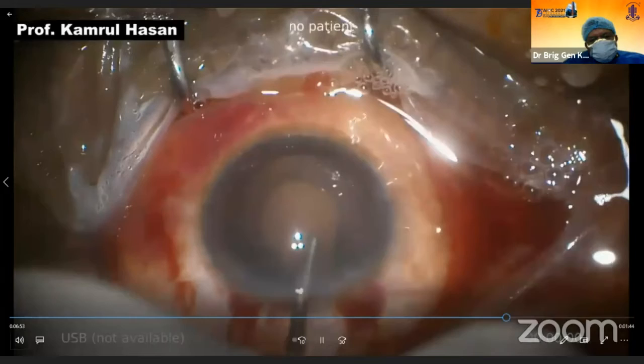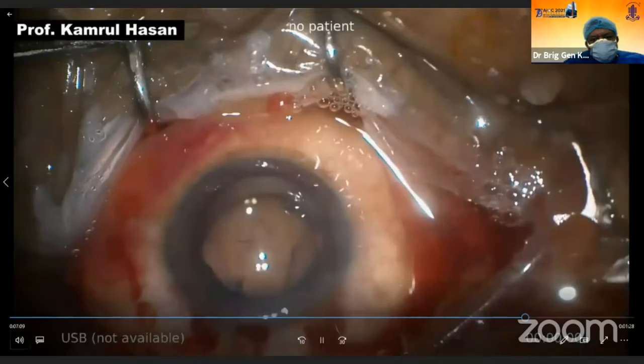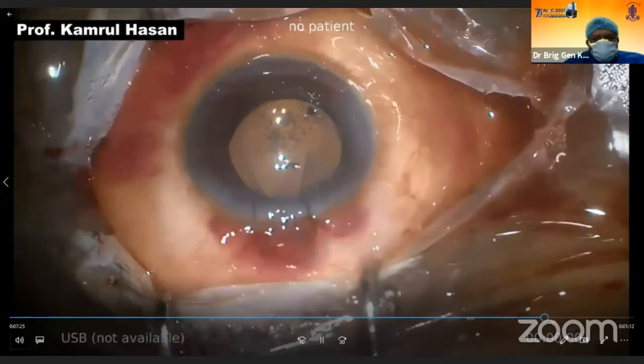And then cortical removal was done. And a PMMA lens was put at the back. And the wound was closed with 10-0 monofilament nylon. Remaining viscoelastic was removed. And the surgery is over.